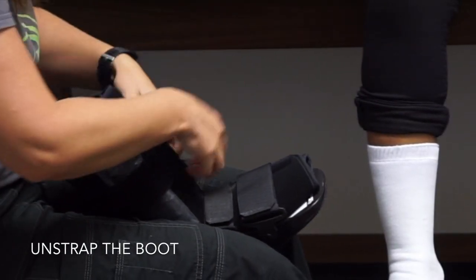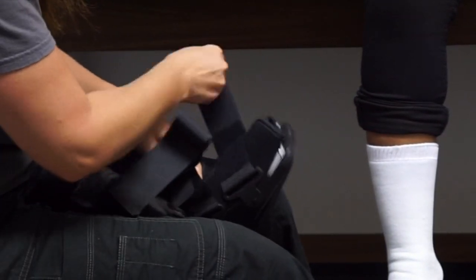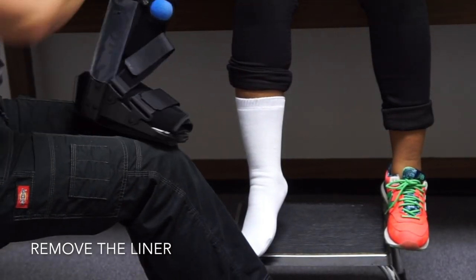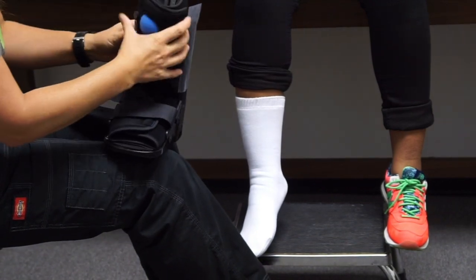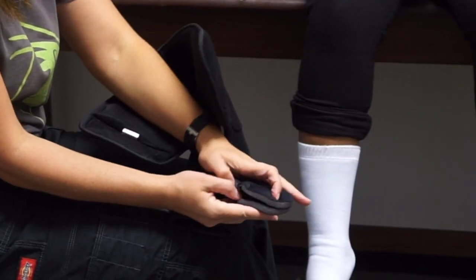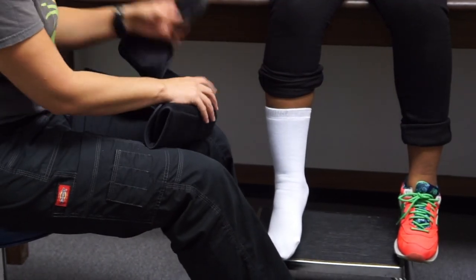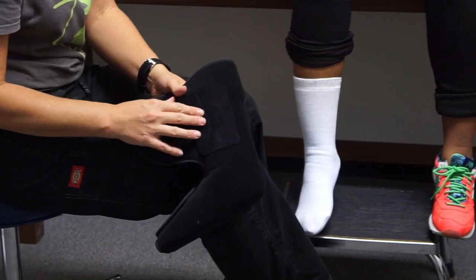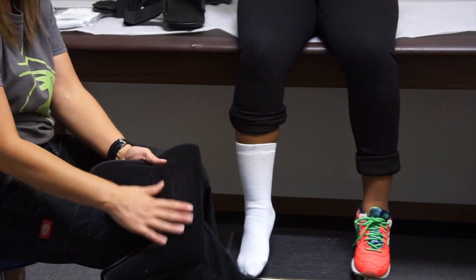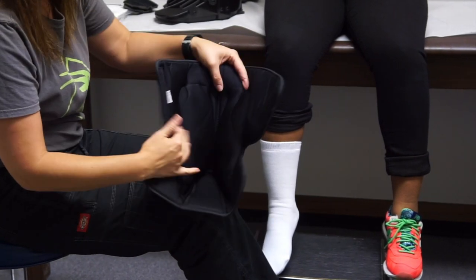We're going to take it apart so we can put it back together and get a proper fit for the patient. The liner is actually going to come out — you remove the strap that goes right above the ankle. Inside the liner you have two pads; these pads can be put wherever necessary, they come with little velcro tabs. The CoreFlex boot has reinforced pads that help protect the patient, and then you just open it up like that.